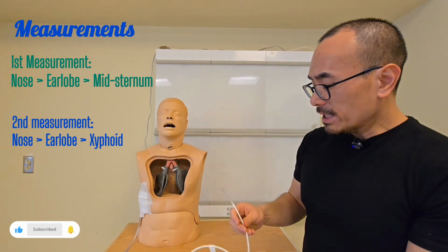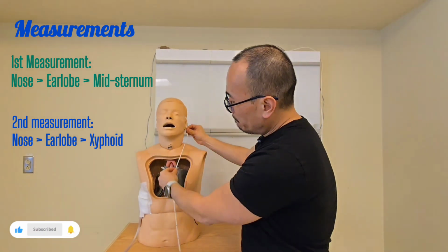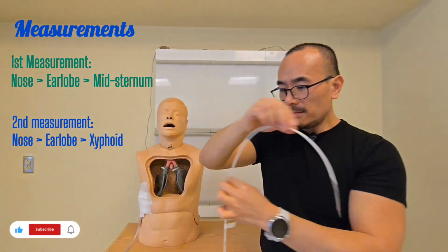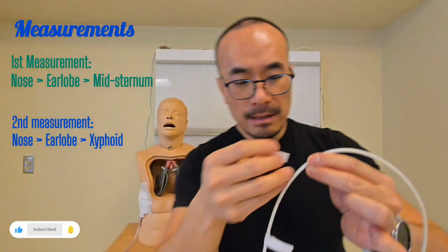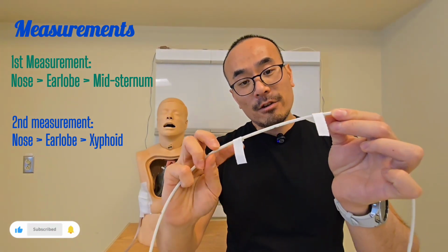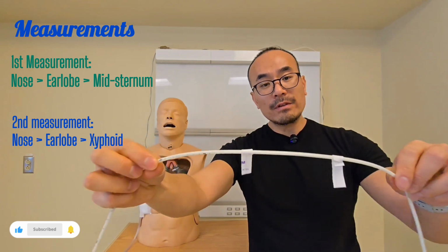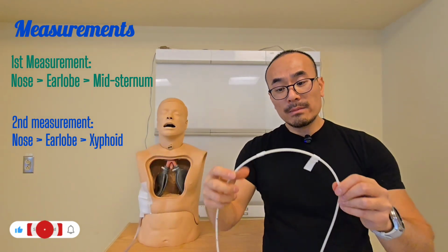The first measurement is gonna be the tip of the nose to the earlobe, to the middle of the sternum, and we're gonna put a marking right there. And the second one is down to the xiphoid process, which we already measure. So for two steps, you should have two markings. For a one step, you should only have one marking.